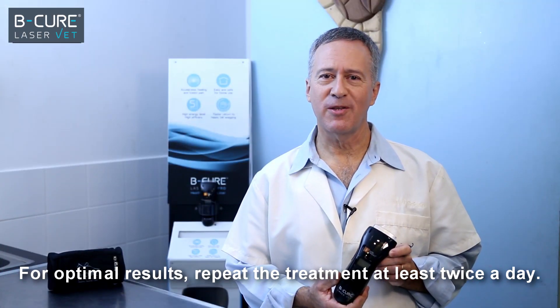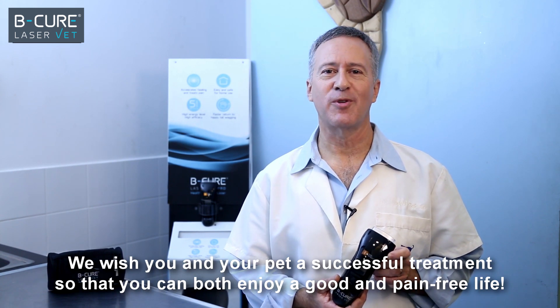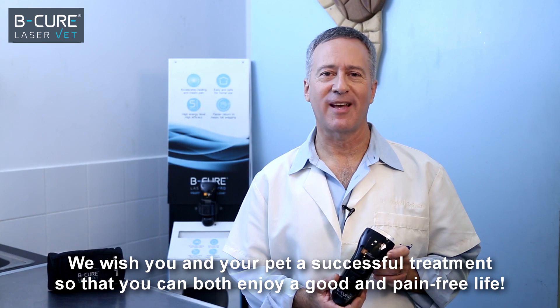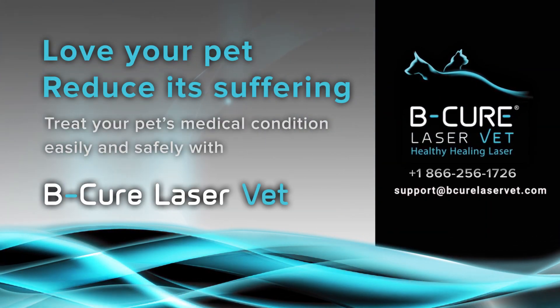For optimal results, repeat the treatment at least twice a day. We wish you and your pet a successful treatment, so that you can both enjoy a good and pain-free life. BeCure LaserVet — stop the pain and heal its source.